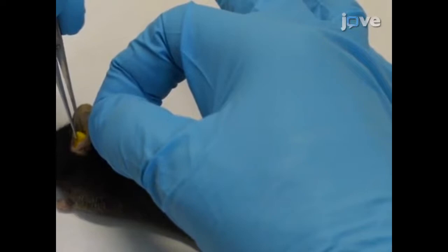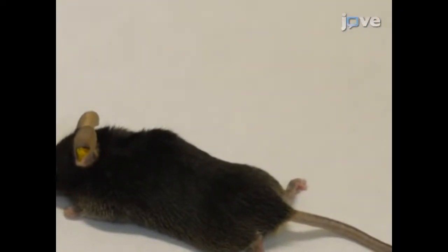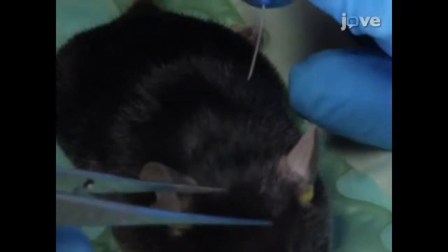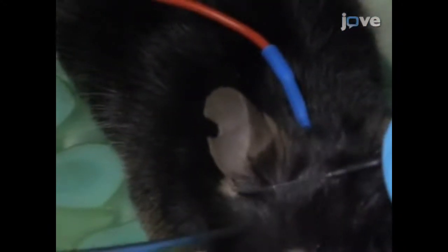To begin, place an earplug in the contralateral ear of an anesthetized mouse to obtain predominantly monaural responses. Then, place the mouse in prone position on a heating pad within a sound attenuating chamber. Place the positive stainless steel subdermal needle electrode in the scalp between the ears over the vertex of the skull. Place the reference electrode in the parotid region below the pinna. Then place the ground electrode in the back, tail, or hind limb region.